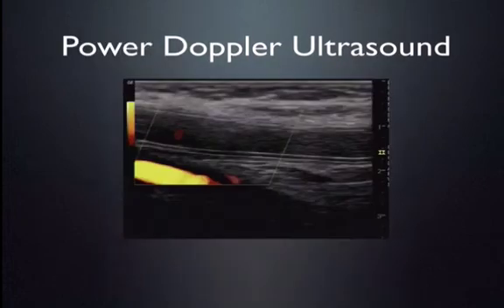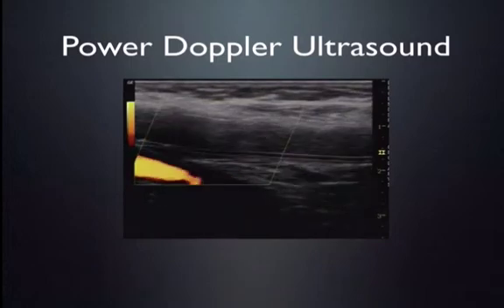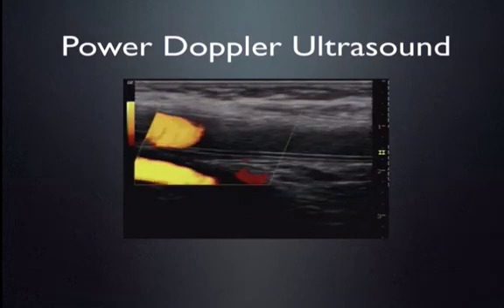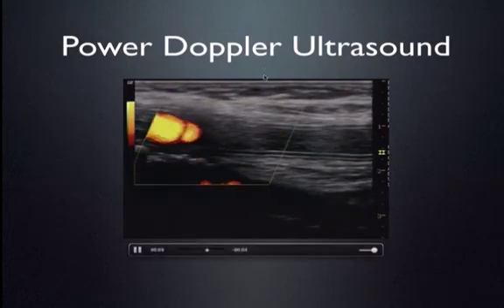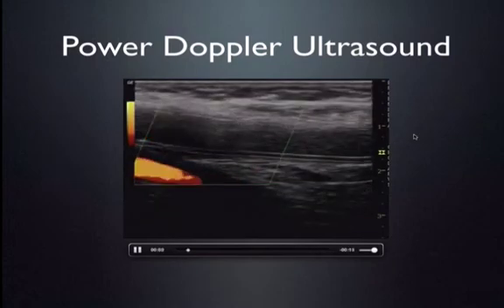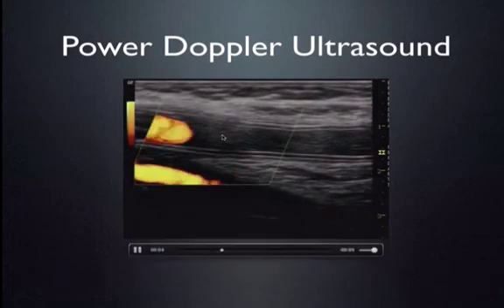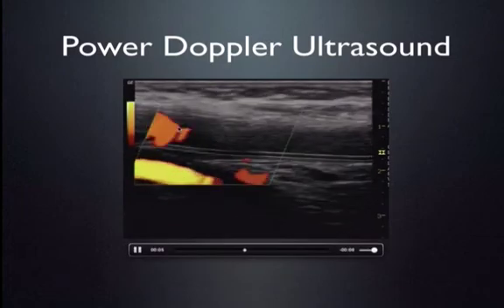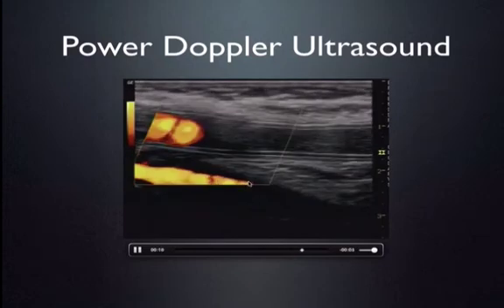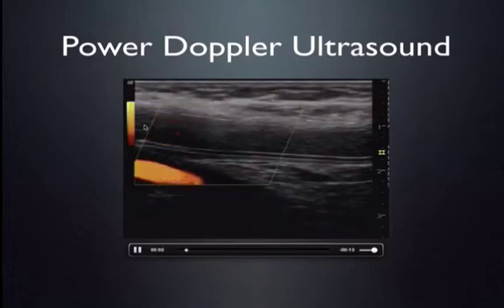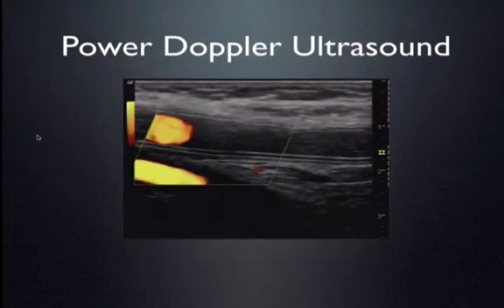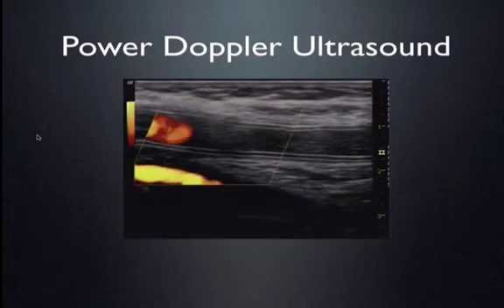Now to contrast that with power Doppler, which we have right here, you'll see that there is really no directional component assigned to this, so we can't tell the direction of blood flow. What we have here is a thrombosed graft in a subject who had a fem-pop bypass, and there's a clot right here, and you can see that blood flow is coming up and then stopping, whereas right here we have the vein, and you can see we do have some blood flow returning. So the direction of flow in this case is this way and then going back across. But we can't tell, there's no color assignment to indicate directional flow with power Doppler.